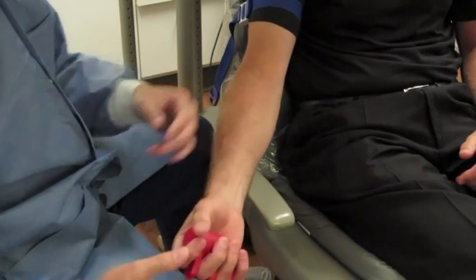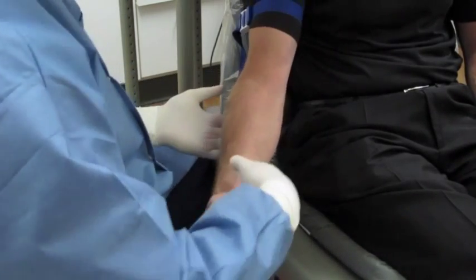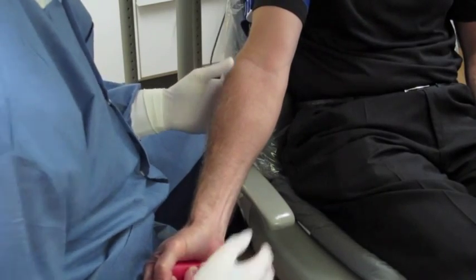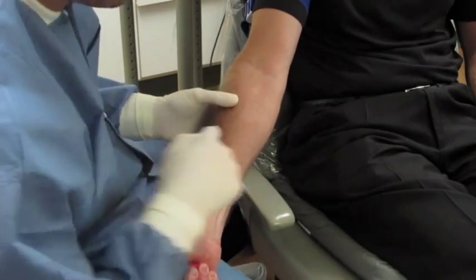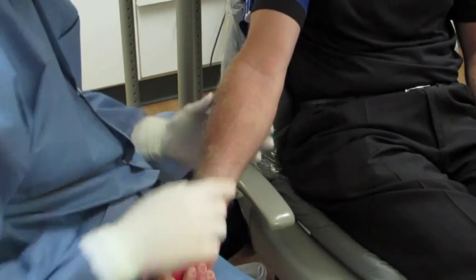There are a few adjuncts we can use to accentuate the veins, one being a stress ball that you don't need to pump — you can just hold stiff. Then unbend the elbow and straighten it so you can see the veins clearly. You can look in the antecubital area, which is the most common place to find a good vein.